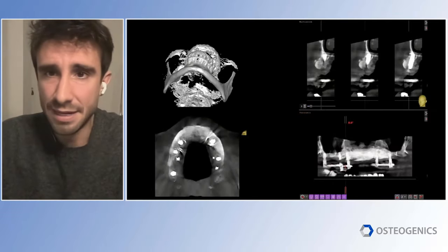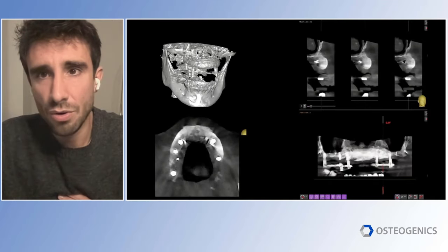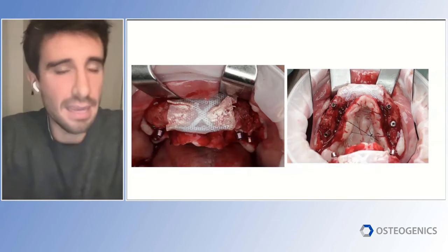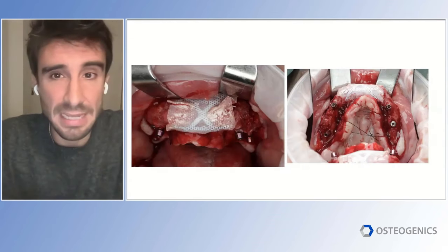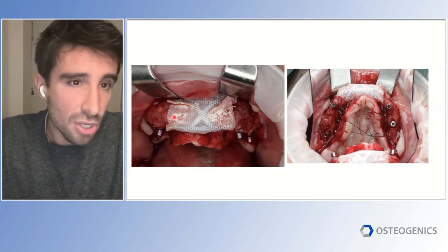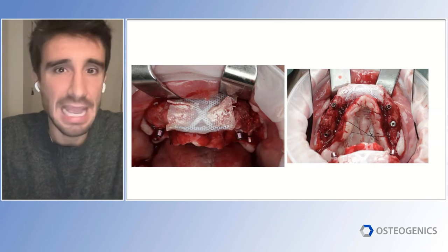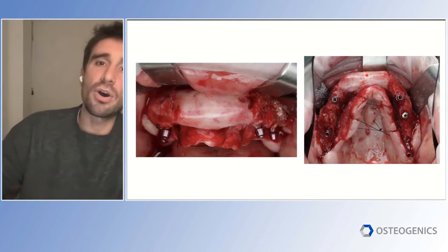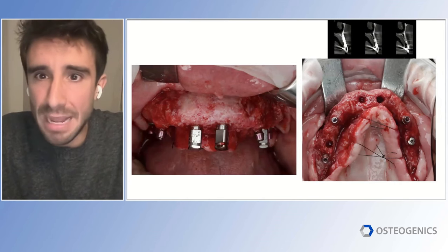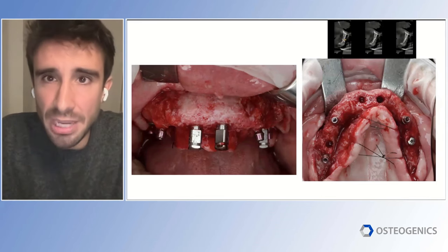Everything heals nicely with very nice bone formation visible on the CBCT. At re-entry surgery, we remove the provisional and the PTFE membrane. Those implants that had buccal dehiscences are now fully covered by bone on both sides — not only covered, but covered by a big amount of bone, a significant buccal plate width over those implants. In the anterior zone, where we had a paper-thin maxilla, we now have over one centimeter of bone width, allowing us to place implants in the perfect prosthetic position with the biological protection they need.